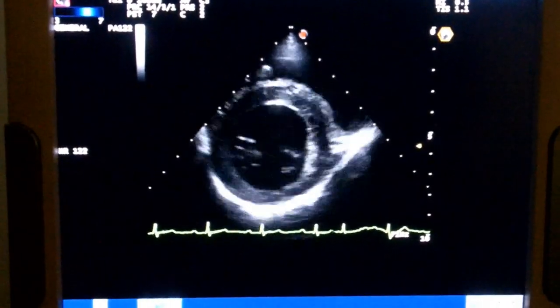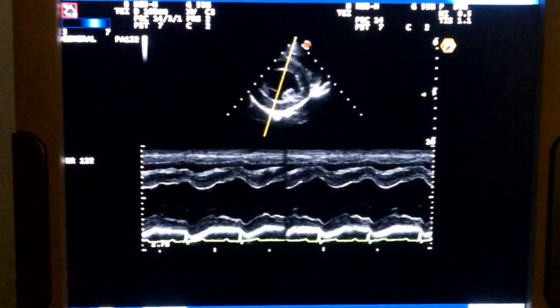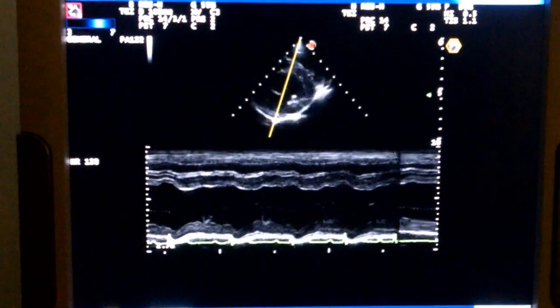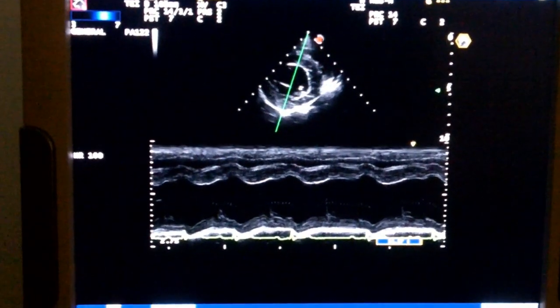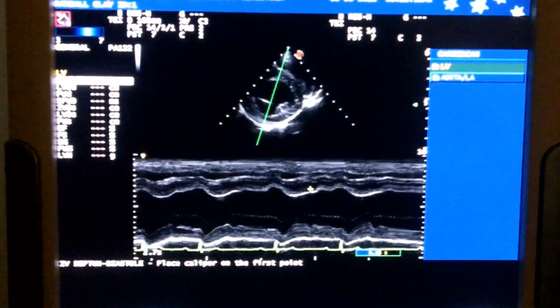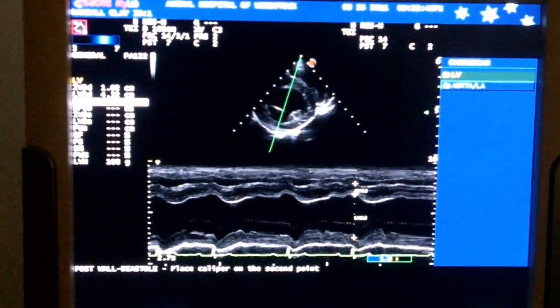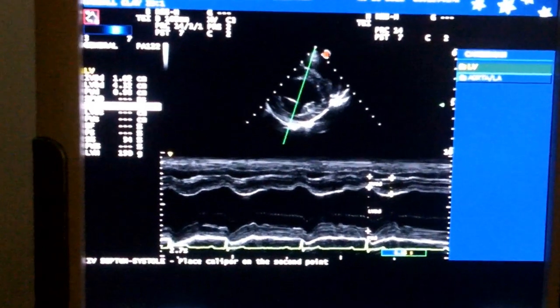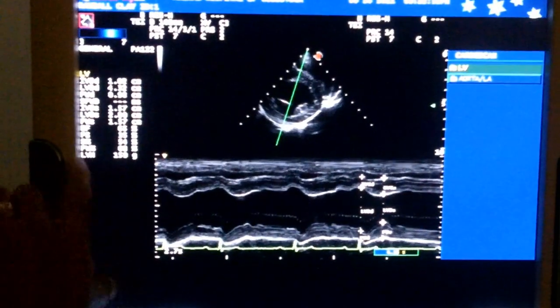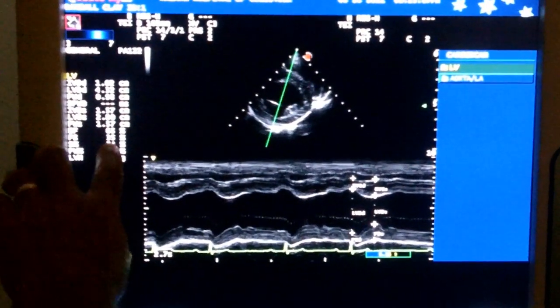Now we can go into M-mode and do some measurements. I like to go up just below the valve. We'll pick an appropriate spot and we can measure for our end diastole and our systolic measurements here. We can see the data that comes up right there — a little low in ejection fraction and fractional shortening for a dog that has mitral valve regurgitation. We like to see that up a little higher, even though it's still in the normal range.